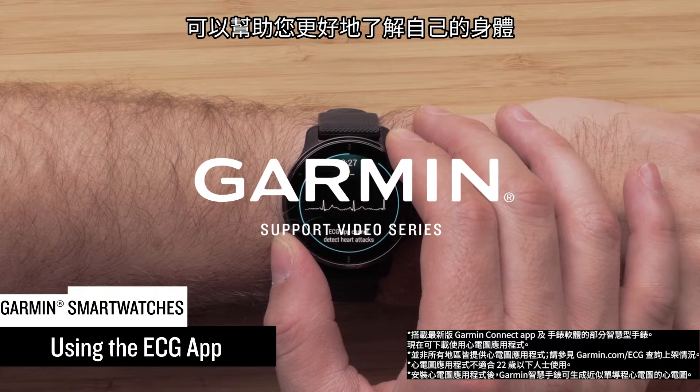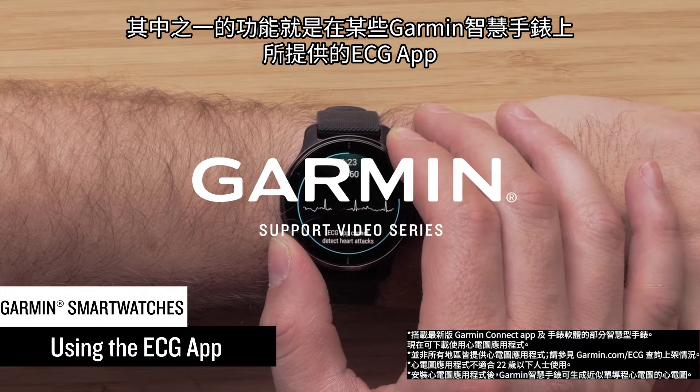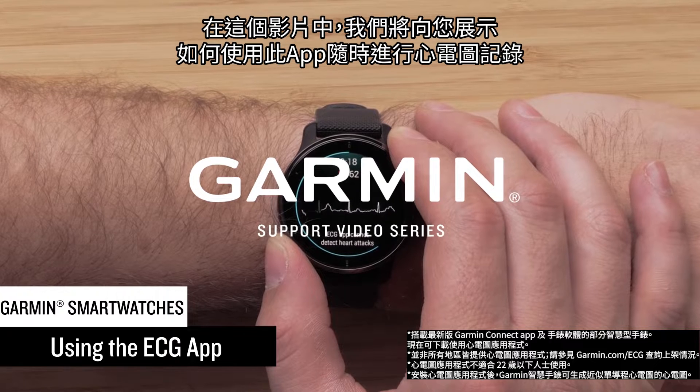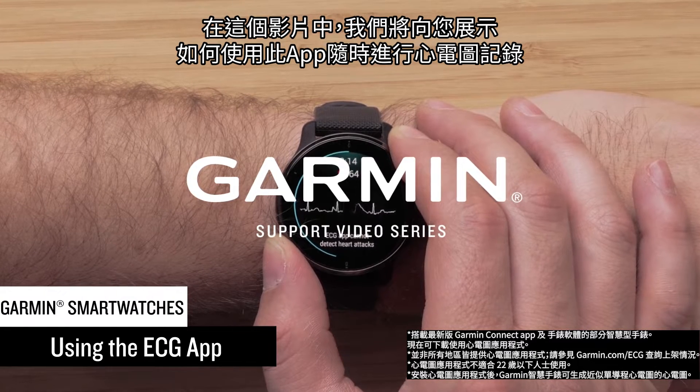Garmin smartwatches have many features that can help you better understand your body. One of those features is the ECG app, available on select Garmin smartwatches. In this video we'll show you how to use the app to take an ECG recording anytime you like.